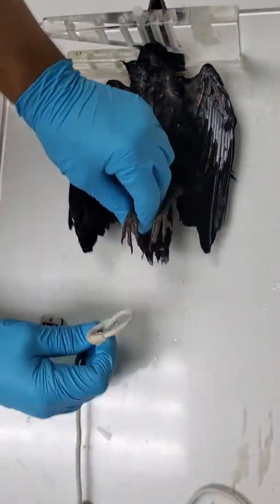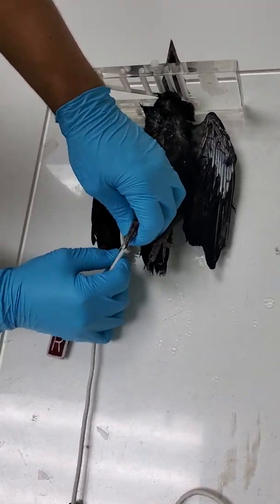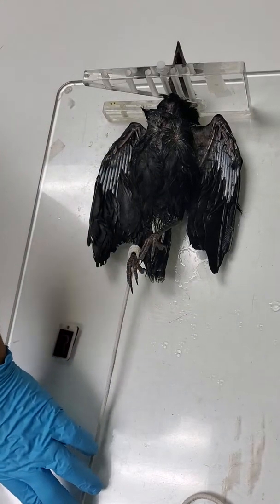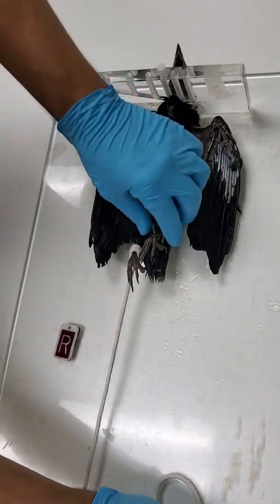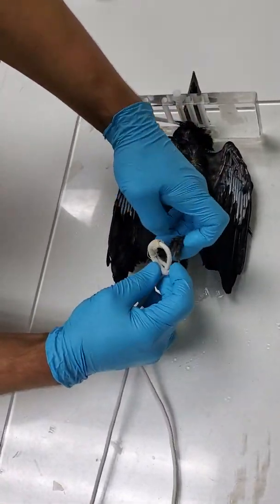I'm going to attach these ropes to his feet, and then just cinch them up and pull them — not too tight. You don't want to stretch the bird out, but you want to hold it in a position that opens up and exposes all of the body to the x-ray.